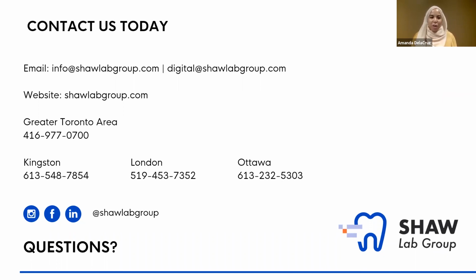I know some offices are trying to go as fast as they can because the technology is so fast, but you want to make sure it's going at the right pace and stitching together properly. That might not be obvious until you've done it a couple of times. It might also be a reason you have holes in your scans. It might not have a chance to capture interproximally, and that's why we end up with holes. We do a lot of troubleshooting here at Shaw. A lot of our technicians are really good at CAD and can try to make it work, but we don't recommend going so quickly.